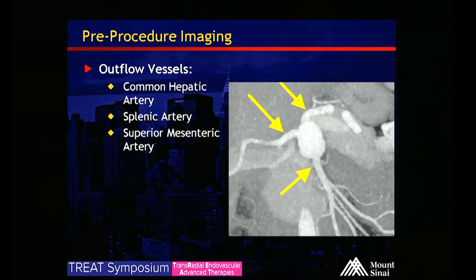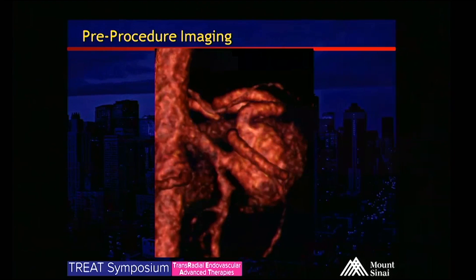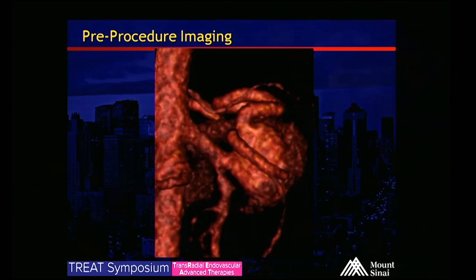Teasing out the outflow here, there are three vessels: the common hepatic, the splenic, and the SMA, as pictured on the MIP image. And this is a 3-D reconstruction which gives you an idea of those three outflow vessels.